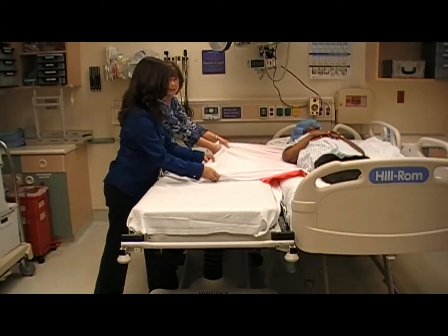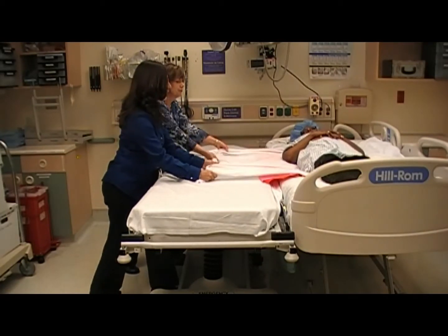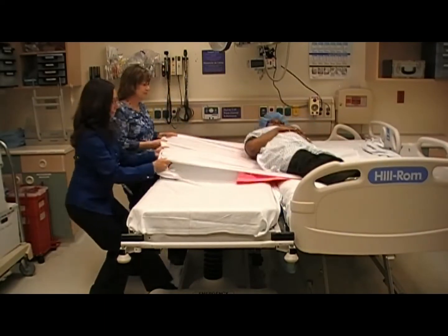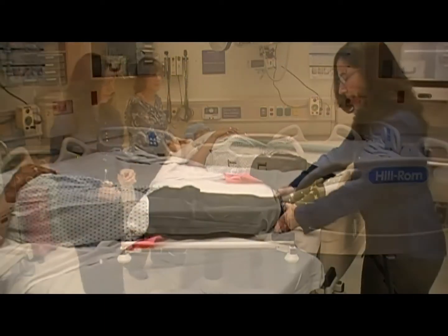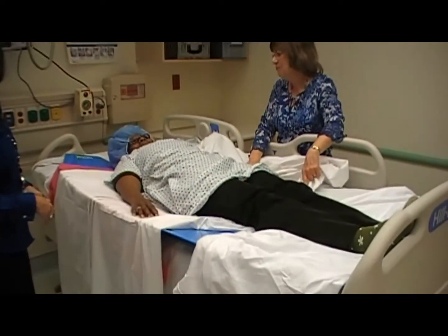When ready to transfer the patient, pull the draw sheet by moving your arms closer to your body and shifting your weight to the back leg. There is no need to lift. The pink slip will loop over onto itself, reducing the amount of force required to make the transfer.